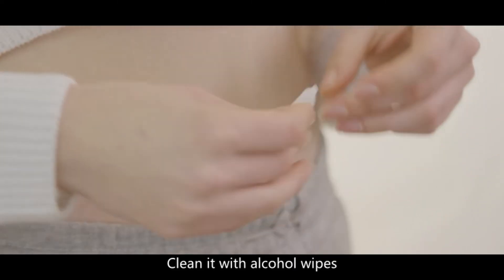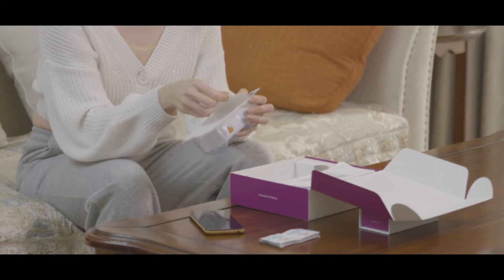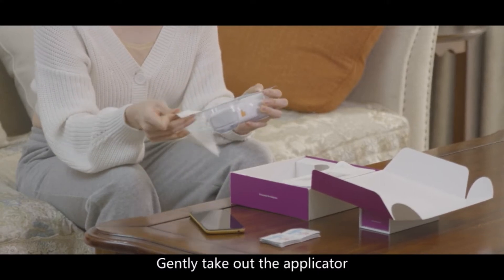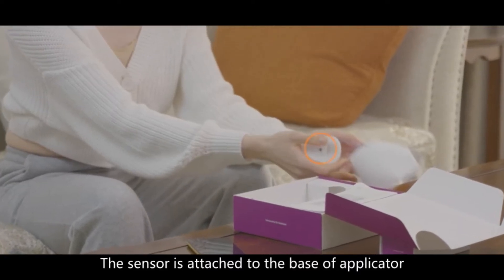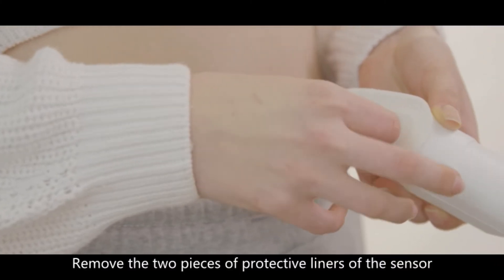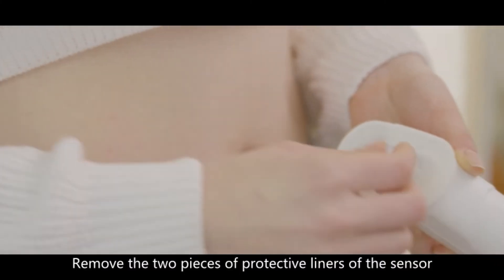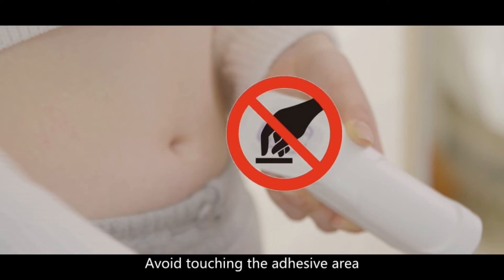Clean the site with alcohol wipes. Open the sensor package and gently take out the applicator. The sensor is attached to the base of the applicator. Remove the two pieces of protective liners of the sensor. Avoid touching the adhesive area.